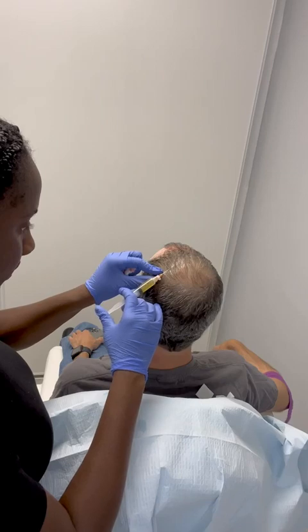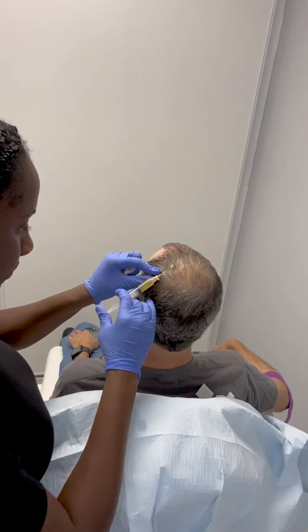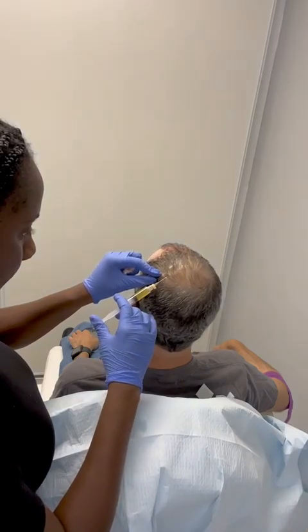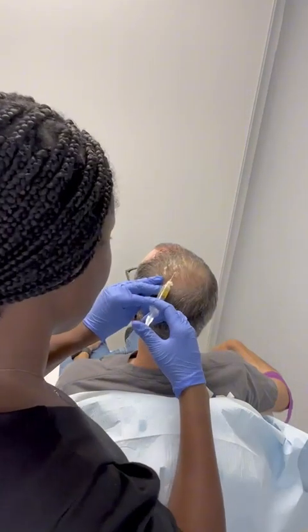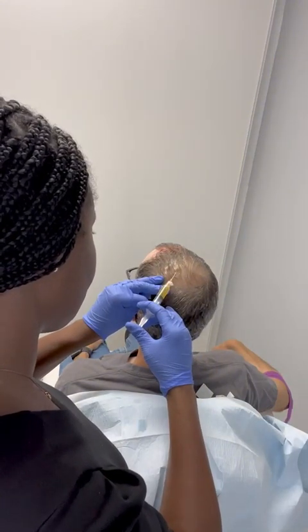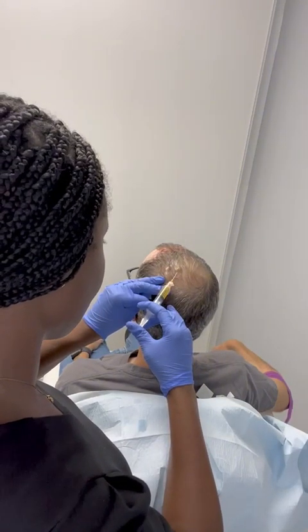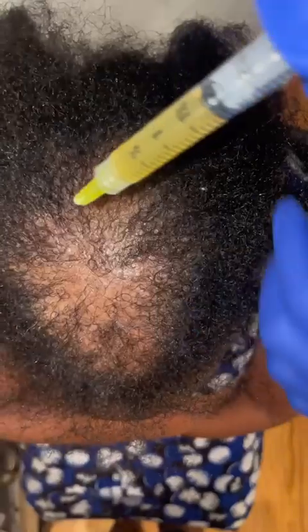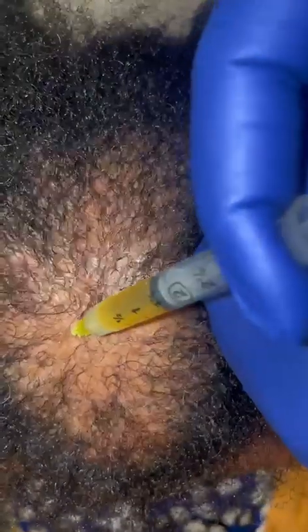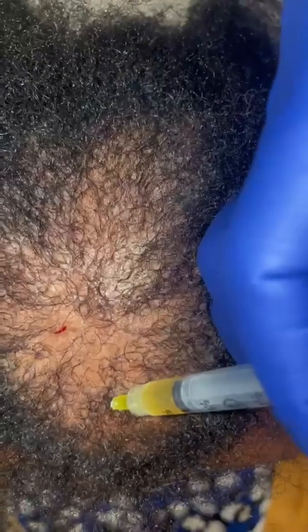You can get the syringe and needle from Juventix and perform this procedure in your clinic. I'm also using hair restoration PRP. Juventix has a PRP kit to perform hair rejuvenation — hair regrowth from hair thinning. Clients have hair thinning problems and you can use platelet-rich plasma to help regrow their hair follicles. Here I'm injecting the client's platelet-rich plasma into their scalp, and also a female client with hair loss, injecting her own platelet-rich plasma to help develop regrowth of those broken hair follicles.